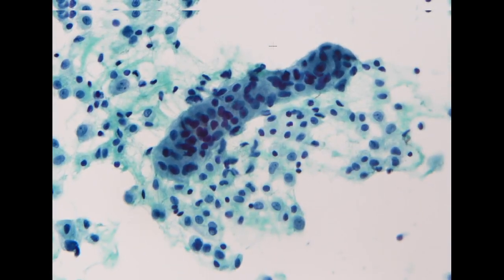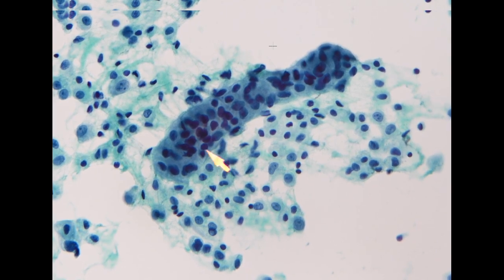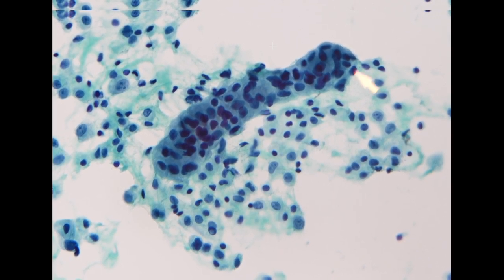These have a tubular type of arrangement. The size of the nucleus is very similar to the adjacent normal cells. It has a little bit of overlapping feature, but that's it. So this looks relatively bland. The only problem is the architecture. It's relatively three-dimensional, and that's it.